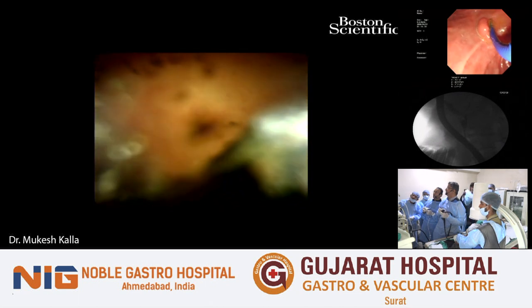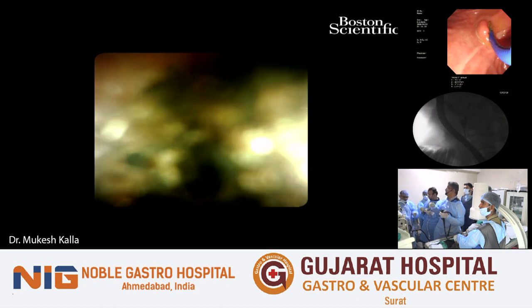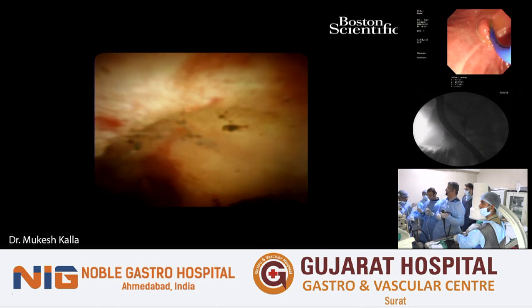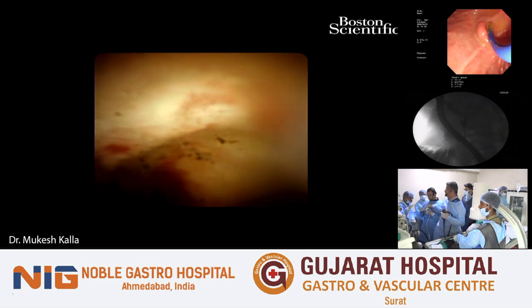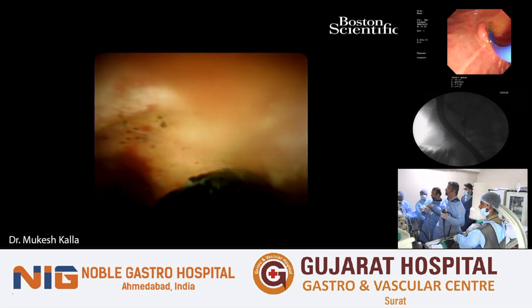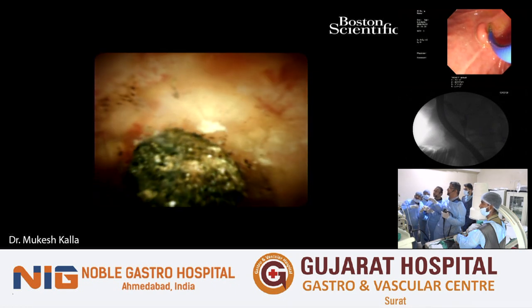So this is the culprit. Put in the basket and catch the stone. Keep it in the center. Yes, in the center. This is the stone.